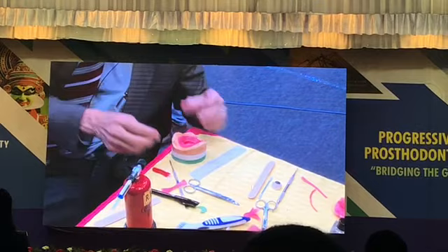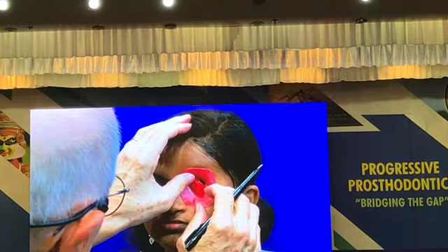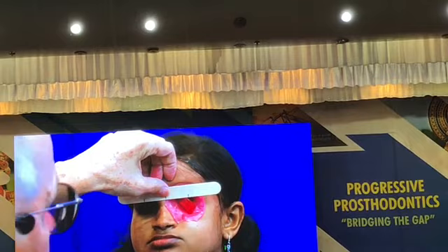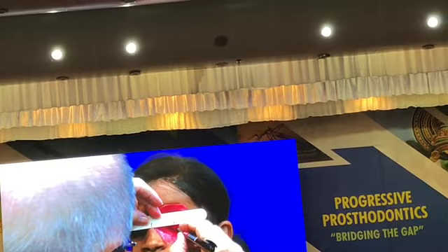Okay, so let's take some wax here. Ready? We've adapted wax to the defect. We had a model made previously, and we take our tongue blade, position it, holding that in position. So let's turn it over a little bit. Put it right there. So I make a mark laterally, and I make a mark right there. Make a mark right there. Make a mark right there.